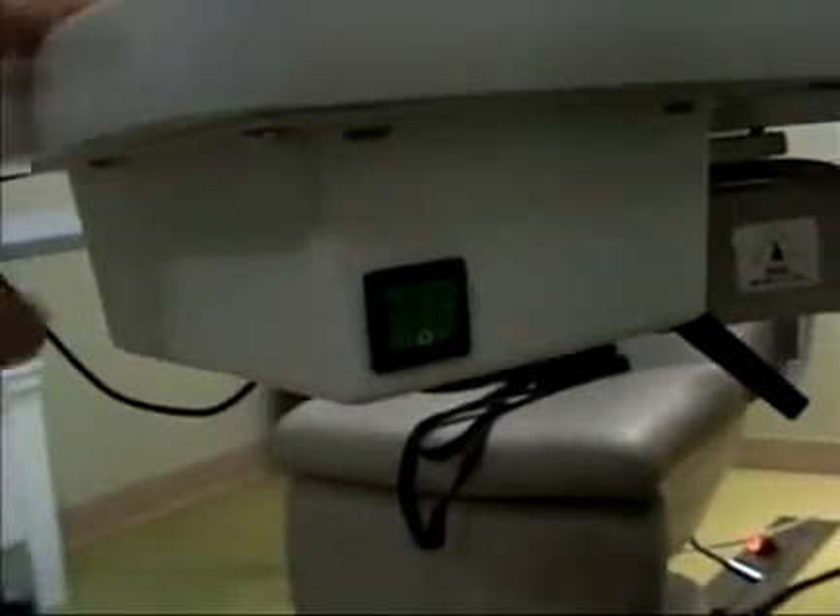I then talked to my parts expert at Lombard Instruments and he suggested troubleshooting it by borrowing one of these boxes from an intact slit lamp, swapping it out to see if it's the transformer box. After I did that swap, I found that it made no difference.